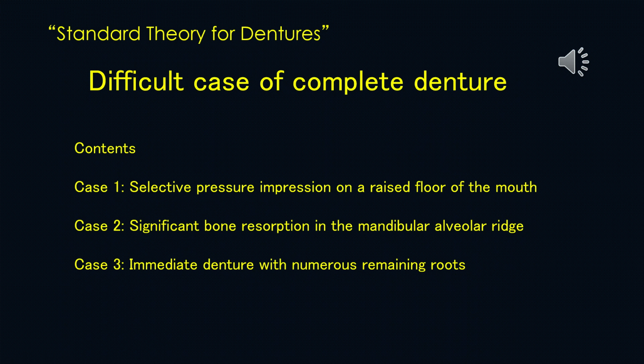Contents. Case 1. Selective pressure impression on a raised floor of the mouth. Case 2. Significant bone resorption in the mandibular alveolar ridge. Case 3. Immediate denture with numerous remaining roots.